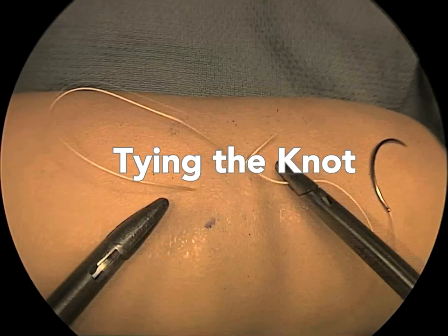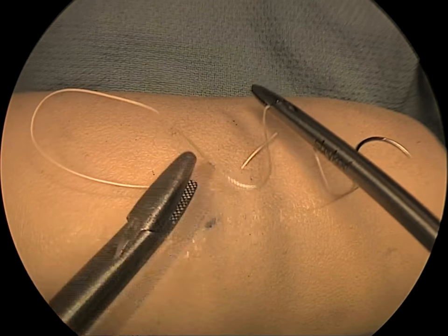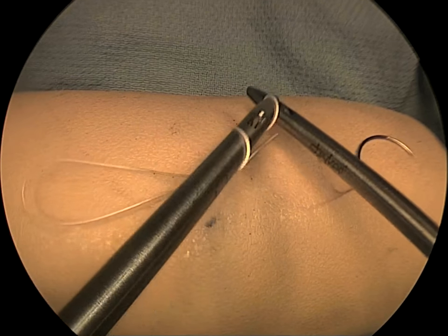In this knot tying sequence, with the needle drive from right to left already performed and the suture length pronated back towards the short tag, the right instrument holds the suture over the tag ready for the first wind. A double forward wind is accomplished.